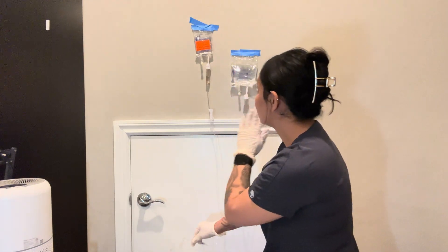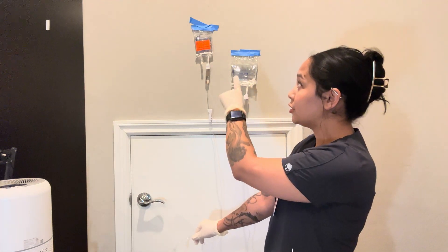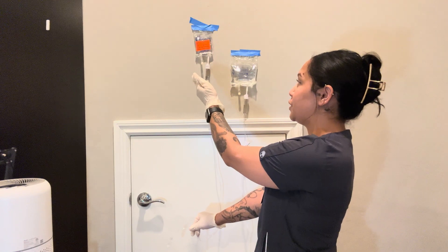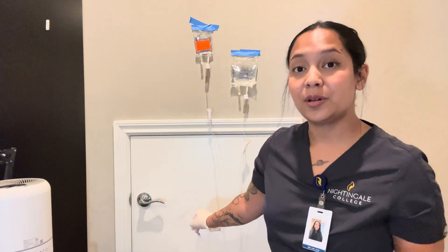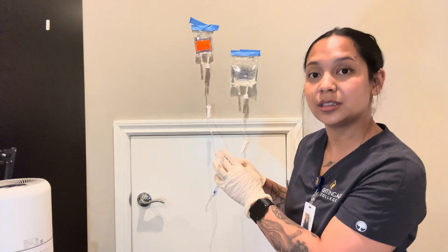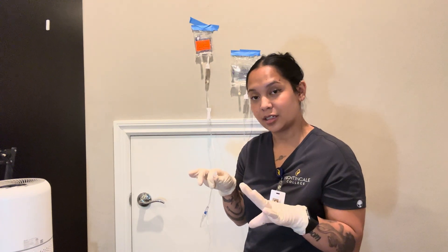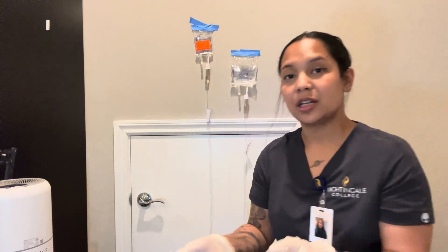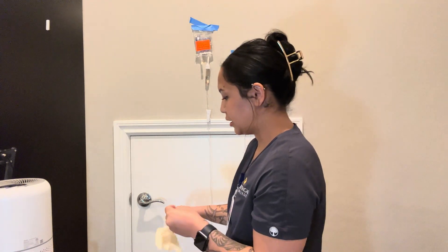I'm using the normal saline with the 250 milligram of amoxicillin in 100 ml of normal saline. This is going to run for 15 minutes, whereas the primary normal saline is going to run for an hour afterward due to gravity. After confirming and checking the patient's wristband to verify the right patient, I'm going to connect this to their IV port using an alcohol swab on both the tubing and IV port. Then I will thank the patient, remove my gloves, perform hand hygiene, leave the room, and make sure I document.